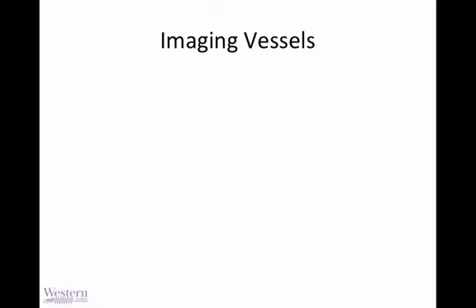Now, you want to be clear which is the artery and which is the vein, and anatomic relationships are usually preserved, but they aren't always preserved. And really being faithful to some of these factors that can distinguish arteries and veins will serve you in good stead. I can guarantee if you do enough of these that you can really avoid the hazardous complex line insertions or know how to navigate them.